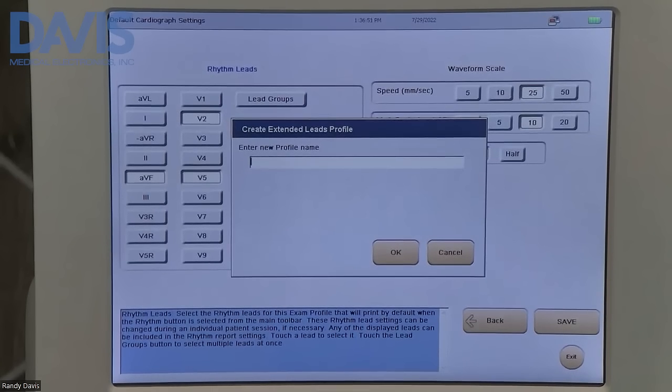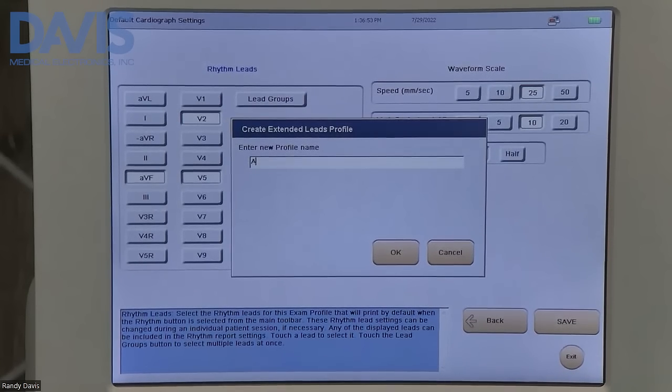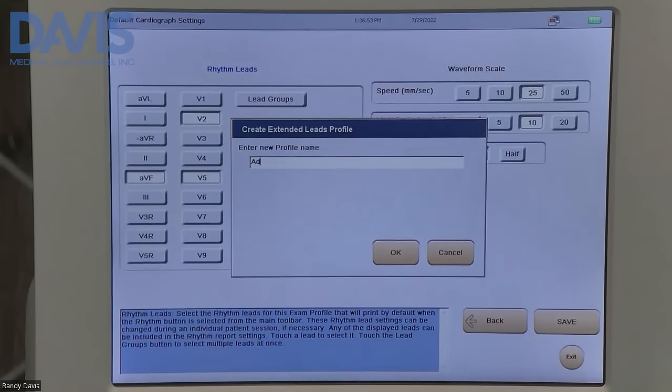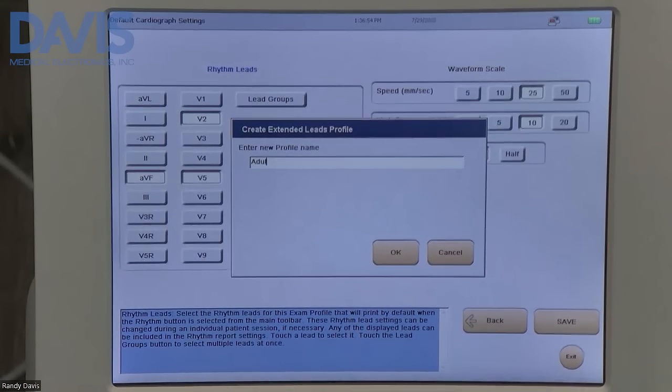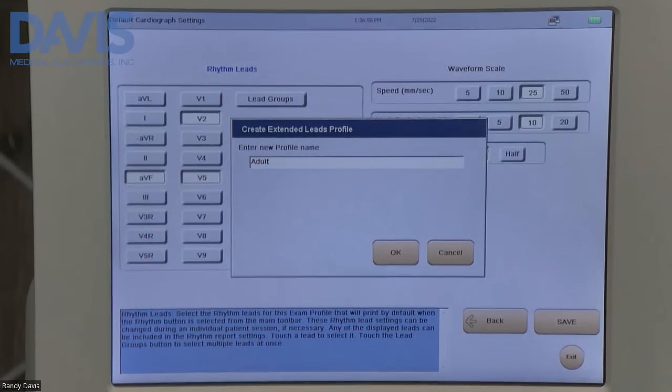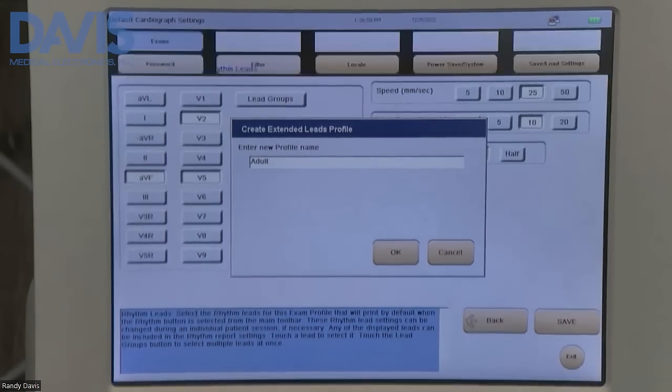You'll be prompted to create a new profile name. Once you create your name, click OK.